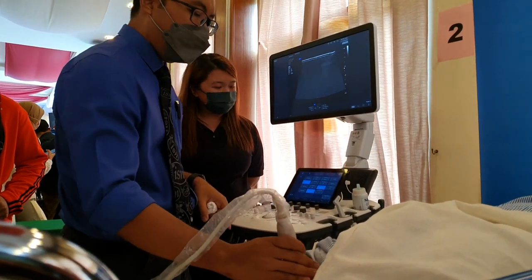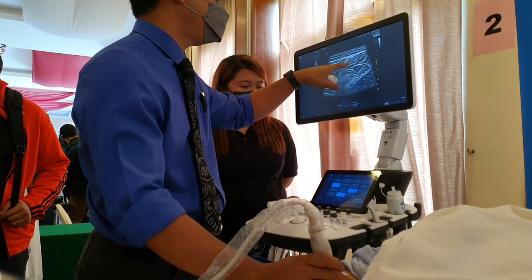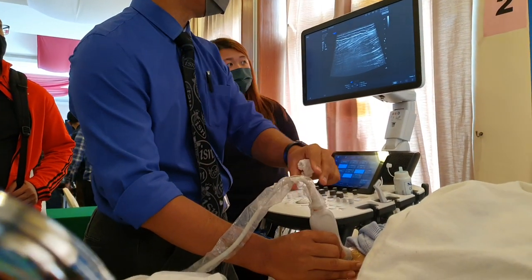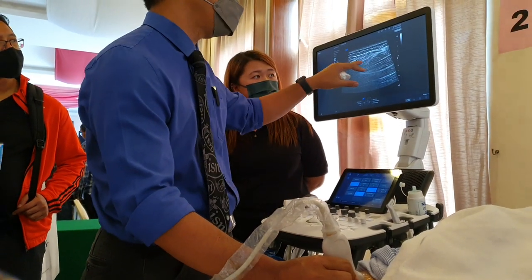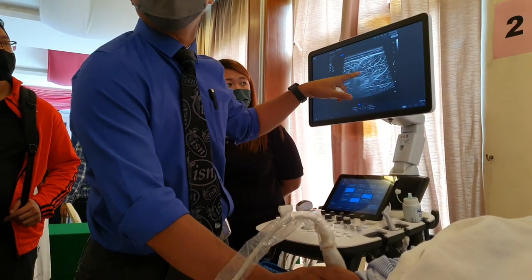Okay, so let's say this area is painful. Okay, let's say this one. And then you see there is a bit of a tear. So you can check with the long axis. Okay, confirm, let's say there is a tear. Next, you want to determine which muscle this is.